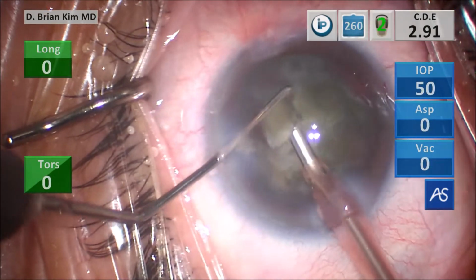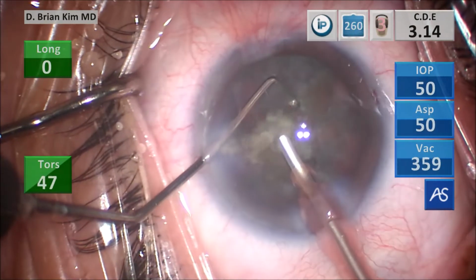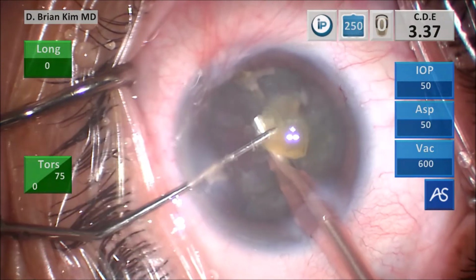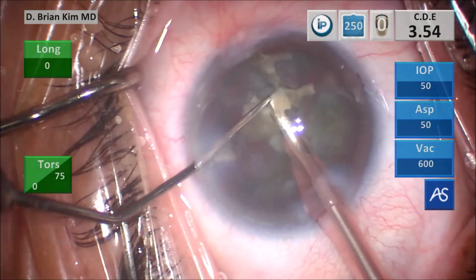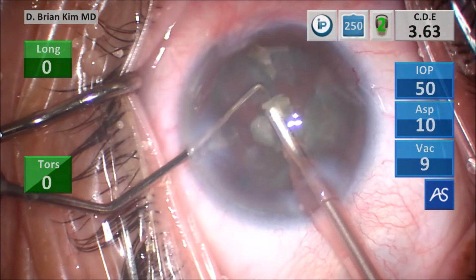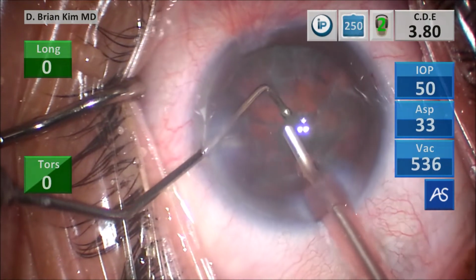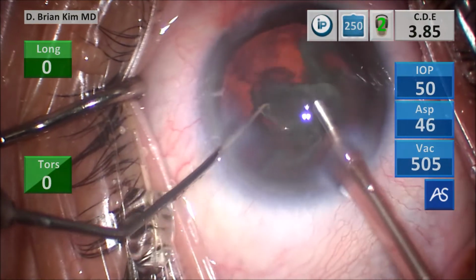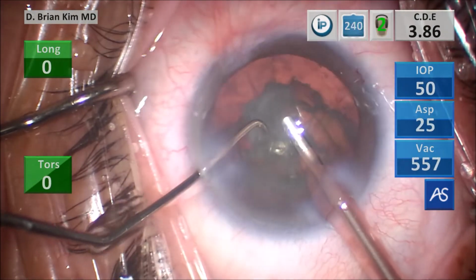Grabbing that fragment up out of the bag, crushing the lens between the instruments into smaller and smaller pieces, and then using pulses of ultrasonic energy and vacuum to remove the lens pieces. Again, by using the instruments as two choppers, that's why it's called double chop, I'm able to very efficiently fracture the lens. Even these small pieces, just crush the lens between the instruments in any which direction. Because I'm not having to hold it with the vacuum, I can fracture the lens against the phaco tip, even off the side of the phaco tip, because the phaco tip is acting like a chopping block. And so that's the versatility of this technique, and this is why I think this is really the best way to disassemble the lens.